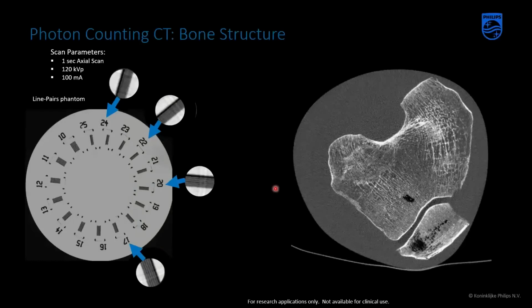And then the very last thing I want to talk about, and then I really think I'm done, is photon counting. So I mentioned this earlier, that with photon counting, we have the ability to not just measure more materials, but also have a high resolution. And this is an example. We have a prototype scanner in Lyon, in France. And this is an example of an image.